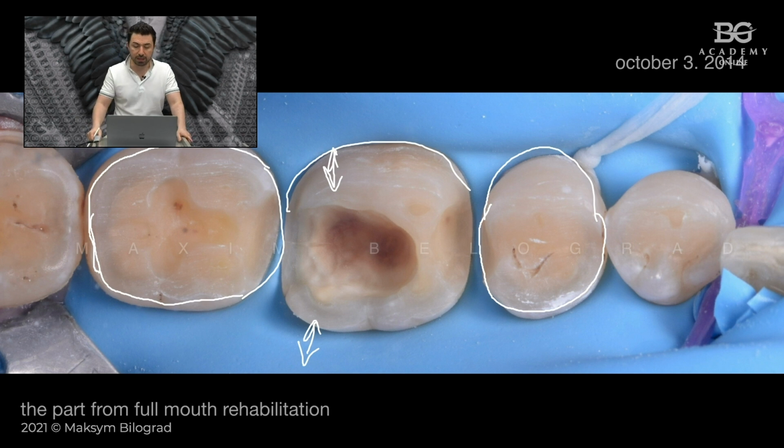By the way, I didn't mention that. If we do, for example, an aesthetic case with no functional rehabilitation, and we are changing the patient's color by 3-4 shades, we will have to do a pretty similar preparation on the lower second premolar, because the vestibular and lingual cusps of the lower second premolar are pretty equal, okay? And when the patient opens the mouth, you can see the occlusal surface. So in most cases, because of aesthetics, we have to go for occlusal coverage of the lower second premolar.